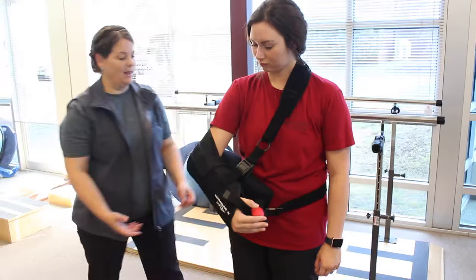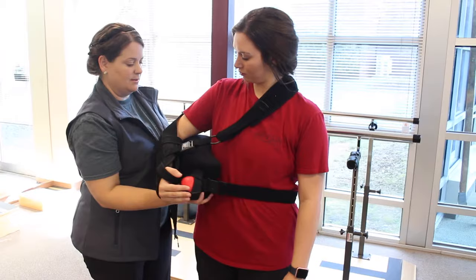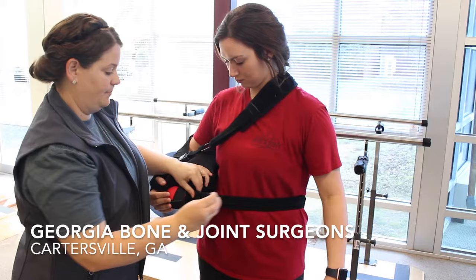If at any point it starts to move too far forward, move it back to the side, relax your shoulder, and adjust the waist or shoulder straps.